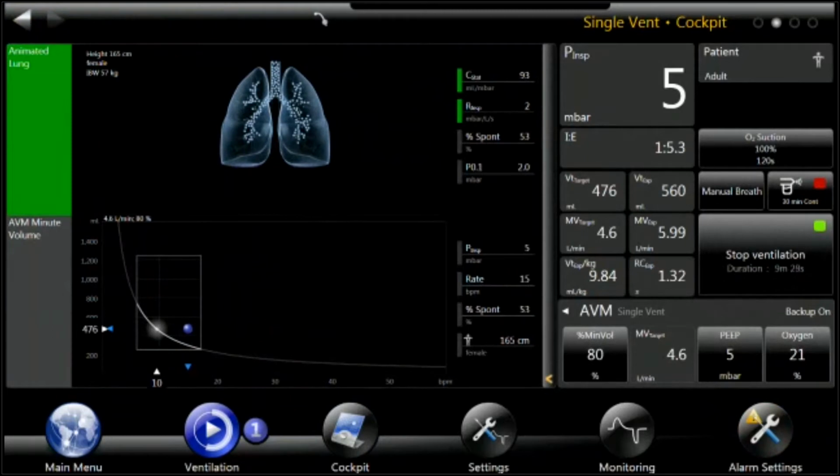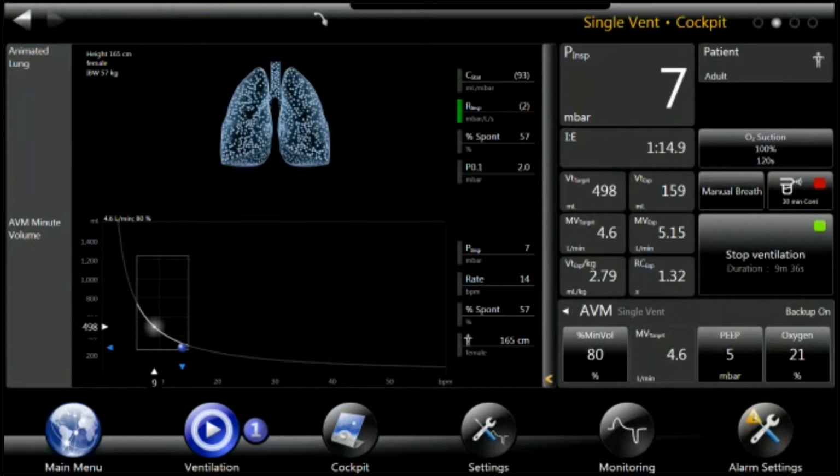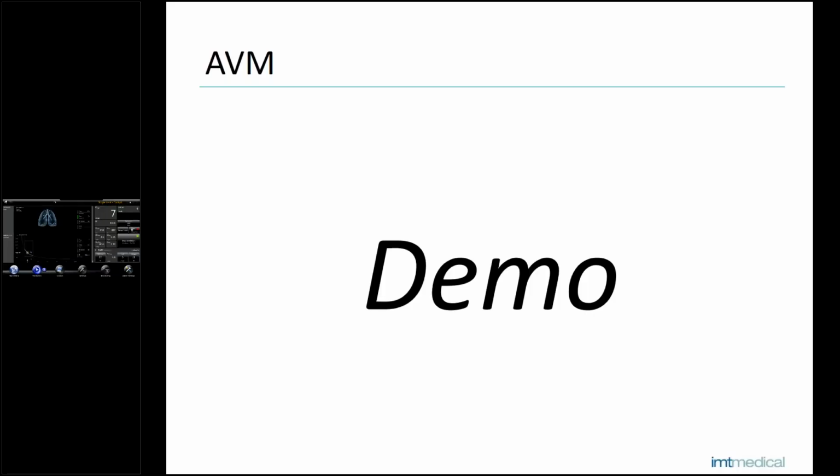It depends on if the patient is breathing strong, then the tendency is to reduce the pressure support, and if the patient is breathing shallow, the pressure support will be increased. When the patient is breathing shallow or is breathing with a higher minute volume than the set target volume, you can support this patient if you want to support him.